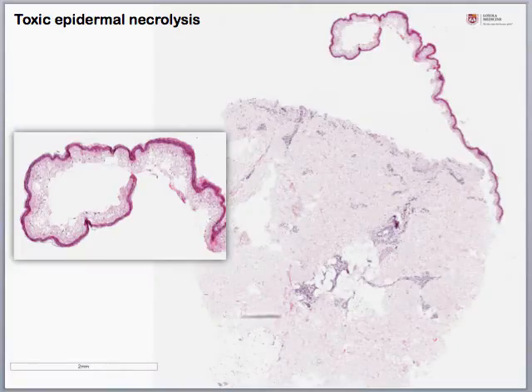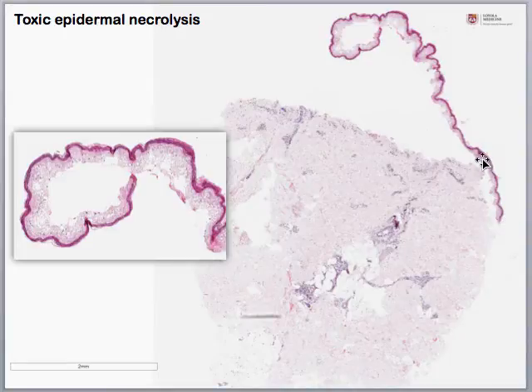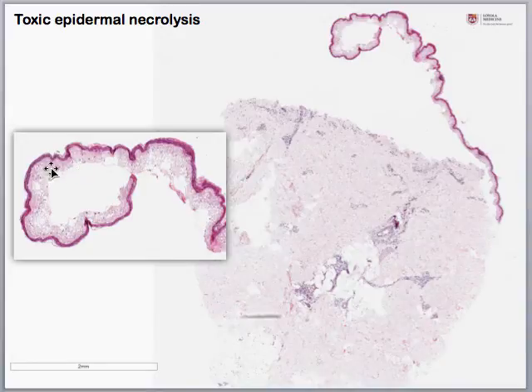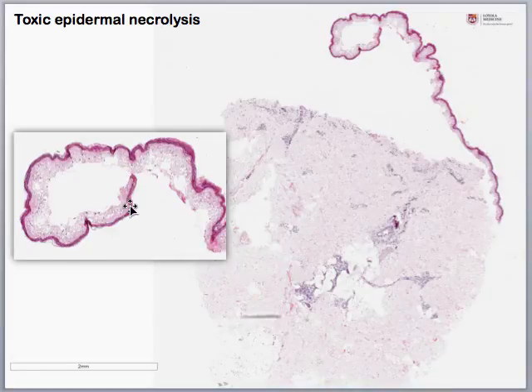The next case is very characteristic — once again we see a subepidermal split. What we're seeing is that the epidermis looks very pink. Normally on H&E stains, viable keratinocytes look purple, but here at medium power all the cells are pink. This means it is actually a full thickness necrosis of the epidermal layer. These features taken together give you toxic epidermal necrolysis.